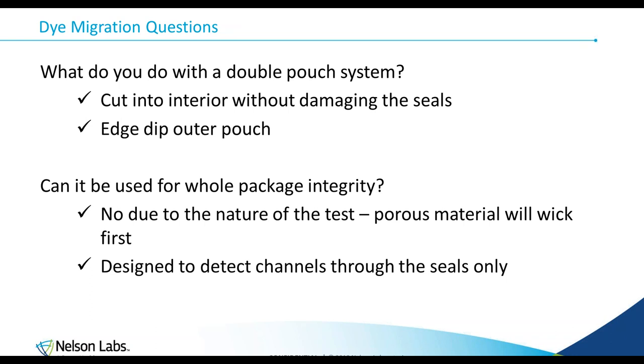What do you do with a double pouch system? Since the dye penetration or dye migration test looks at the seals only, it's not a whole package integrity test. You evaluate the seals only. You can cut the interior without damaging the seals, test the pouch, and then you can do the edge dip test on the outer pouch.